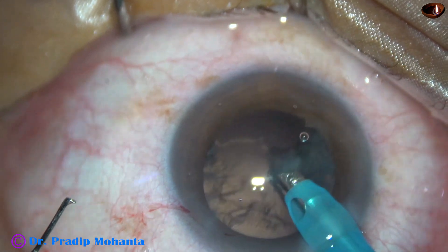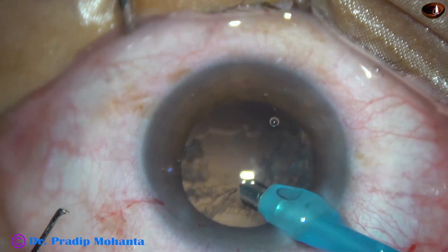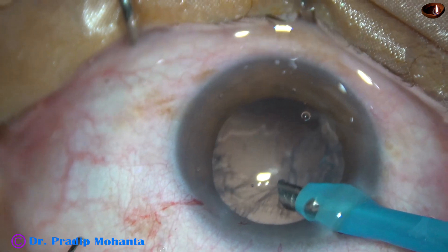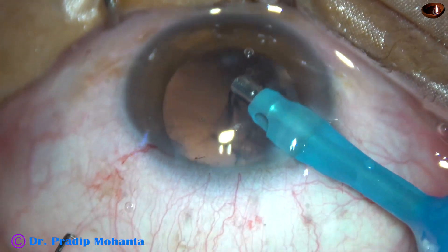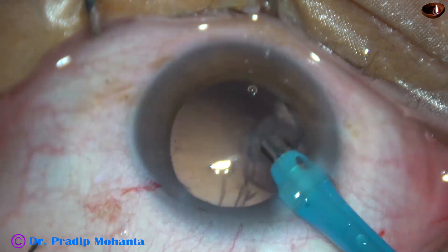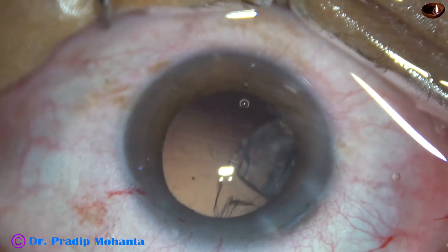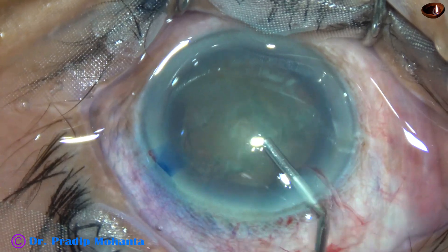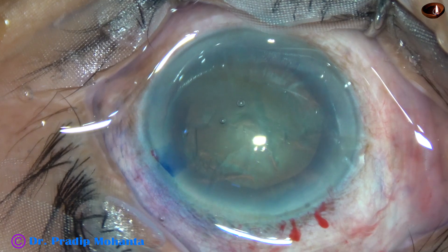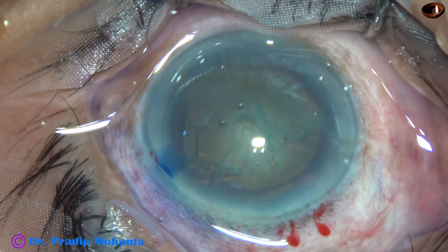By the phaco needle itself, we can remove a lot of cortex, and in some cases we can remove the whole cortex. But safety first — we must look at the safety of the patient first. This is the second case.